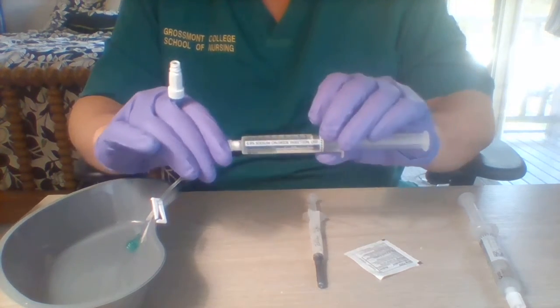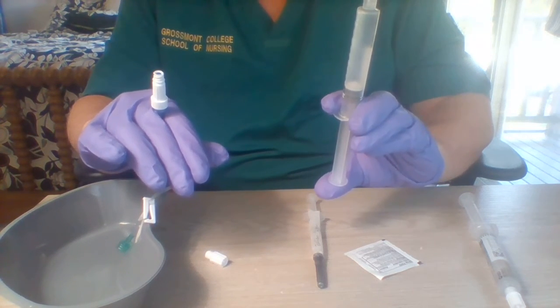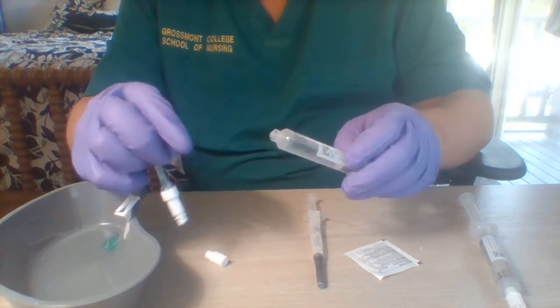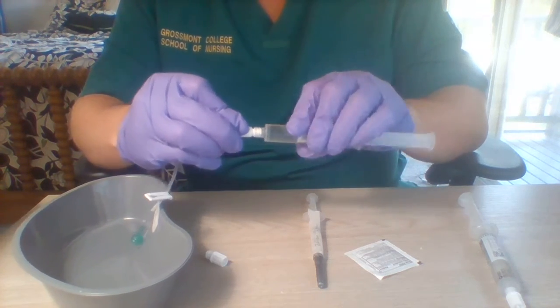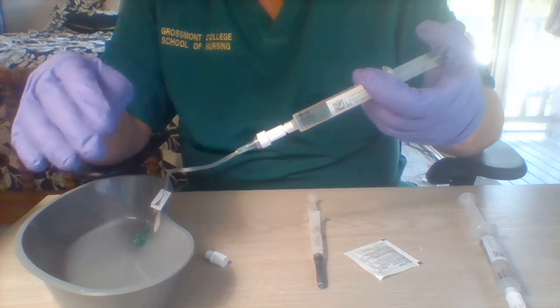I get my first flush. Make sure there's no air in the flush. Connect it. And I need to slowly aspirate the IV site for blood return.